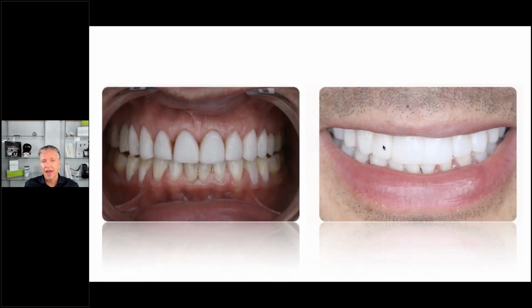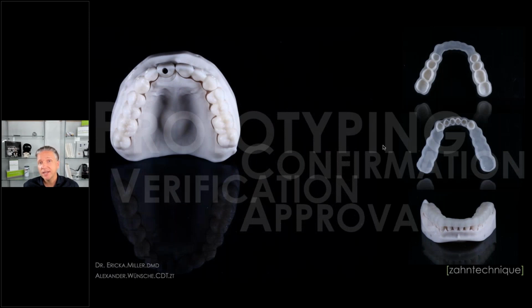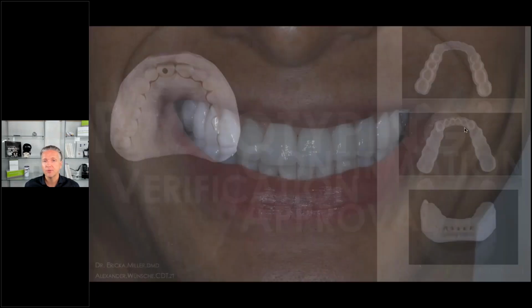A little more tricky is if you have no implants, or just one implant, maybe in all teeth. In this patient, for example, we had to do a full mouth rehabilitation, so we did upper and lower. On the right side, we see the temporary. How did we do that? We did the same thing. We made shells, and then we created 2 seating jigs, so we seat these shells in stages. The doctor first preps the posteriors, and the shell fits over the current anteriors and then over the posterior preps. Then we reverse it. The second seating jig fits over the new posterior shells and the preps of the anterior, and it can be seated. Same scenario, just with 2 seating jigs, but it also keeps full control over everything.